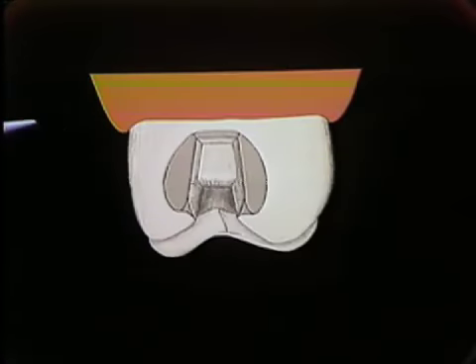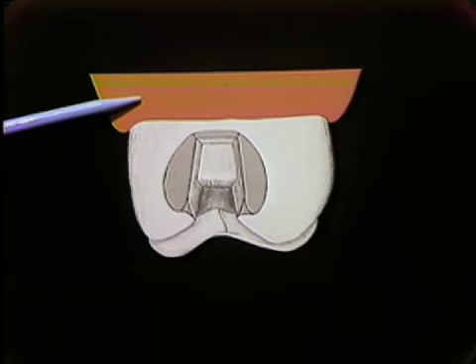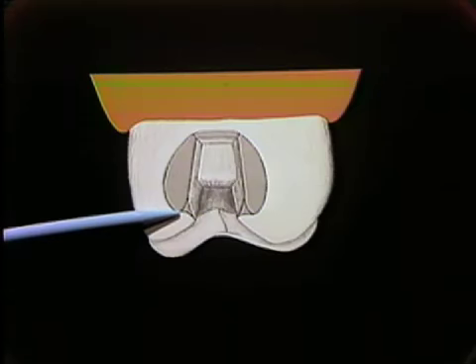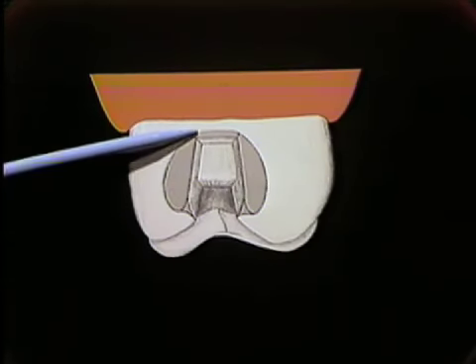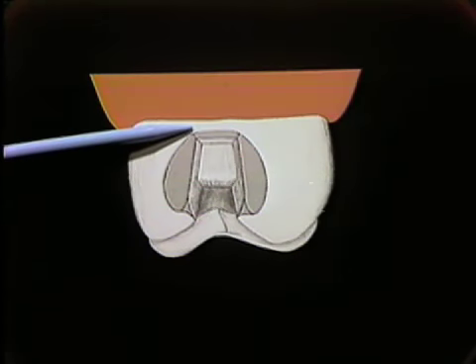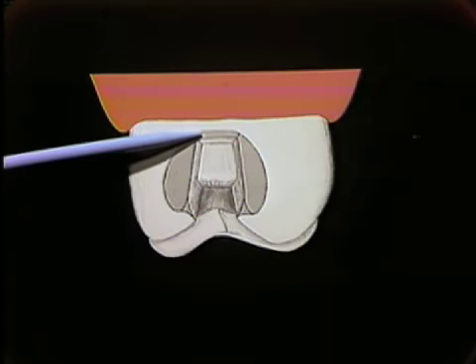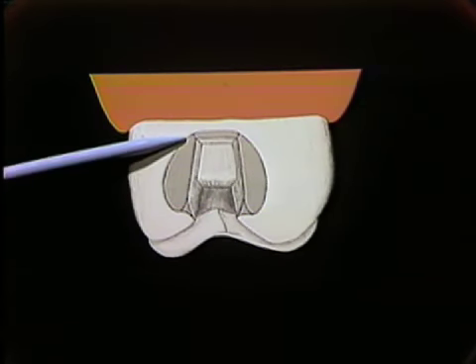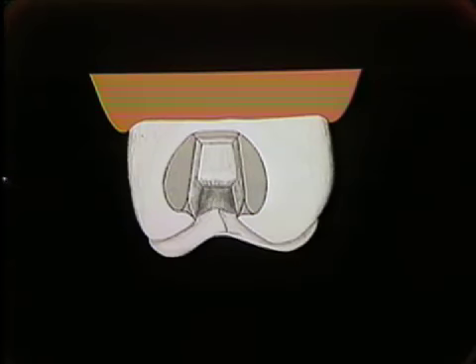With this view of the full tapered slice, you will note that the slice itself comes from the cervical to the occlusal in one plane on both the buccal and the lingual. The slice is actually covered beyond the cervical floor, and then this is increased or enhanced with a bevel, as you can note here. The full tapered slice is seldom used anymore. It is not necessary with our elastic impression compounds to use a full tapered slice in order to take an impression.